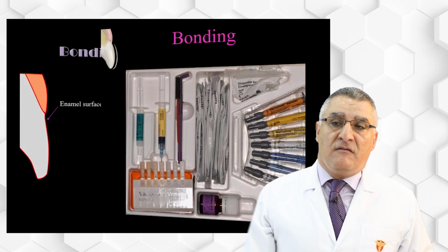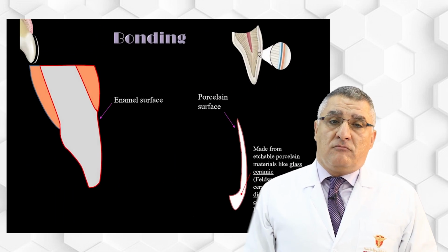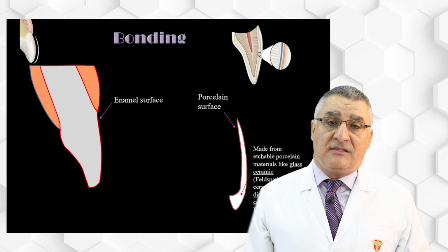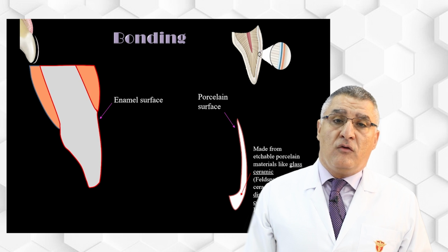Bonding of veneer will involve management or surface treatment of two surfaces. The first is the tooth and the second is the ceramic. We start first to treat the ceramic, and then we will go for the tooth.